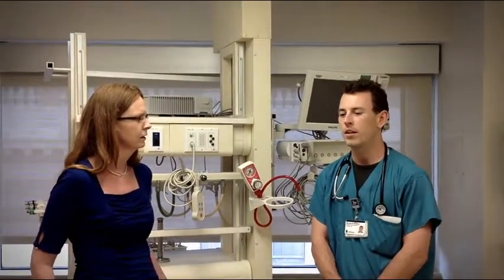So you mentioned auto-PEEPing. What does that mean? So auto-PEEPing is also known as air trapping. For intubated patients, they usually have trouble exhaling completely. This is most commonly found in patients with obstructive airway disease, such as COPD. One way to limit auto-PEEPing is to decrease the respiratory rate. That gives them more time to exhale fully. You can also administer bronchodilators through the ventilator to help relax the smooth muscles in the airway.